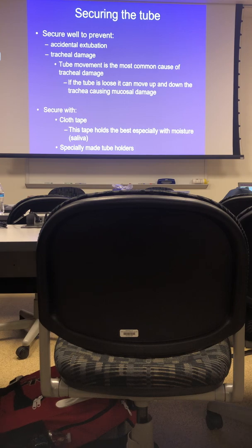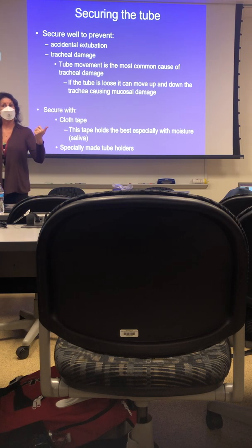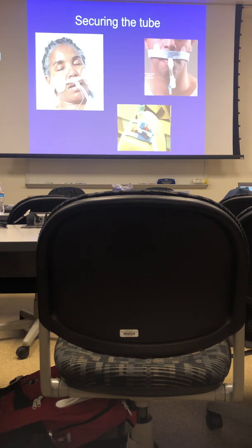Any questions about measuring the cuff? Do you see the importance of keeping that cuff pressure measured? We don't want to cause any VAPs. We don't want to cause any erosion of the tissue. So we used to tape with cloth tape, but now we use holders. The holders I showed you, and those are our holders. They're very nice.